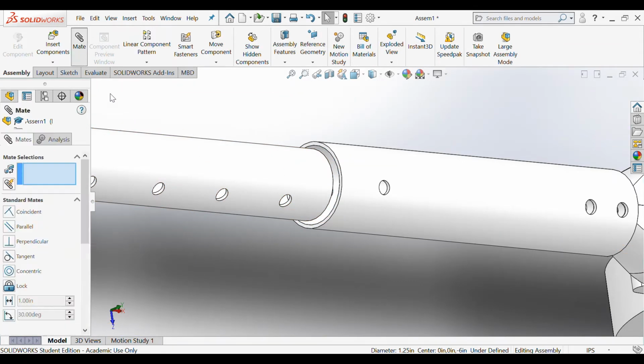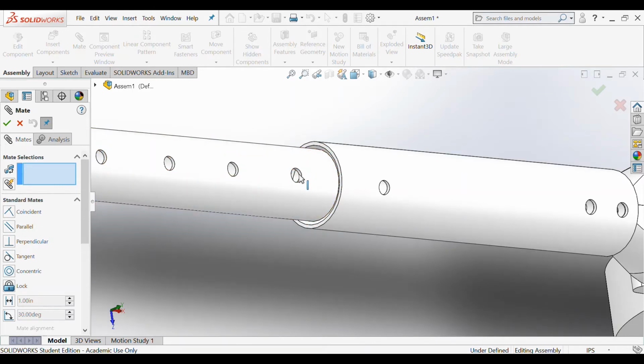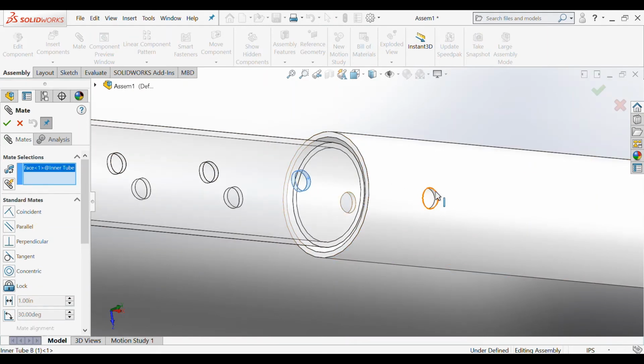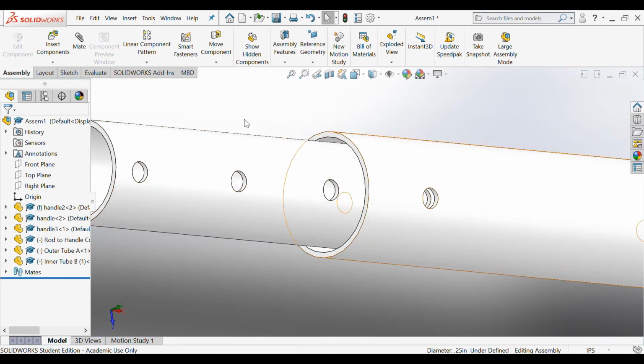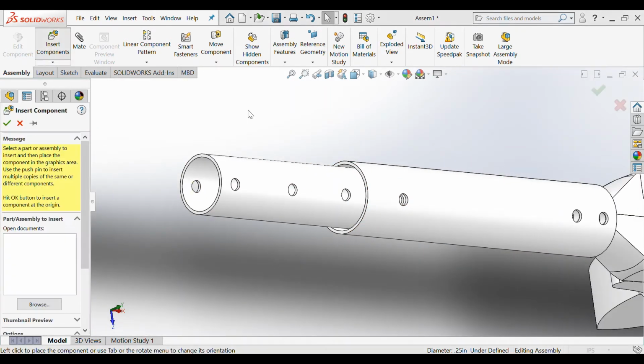And then we're going to do one more mate. We're going to mate the inner part of the circle on the inner rod and the inner part of the circle of the outer rod and make them concentric as well to align the holes. Next, we're going to insert the lateral hinge piece.